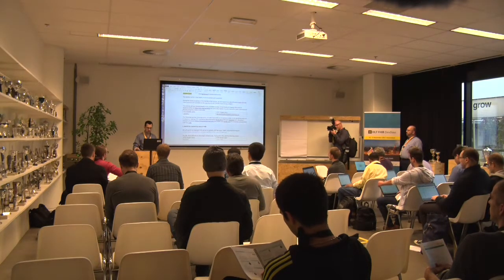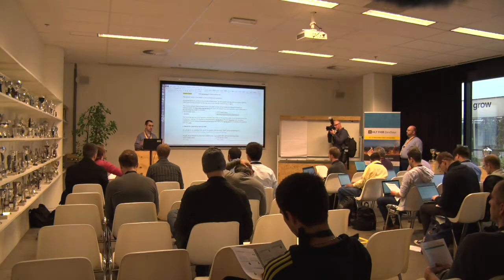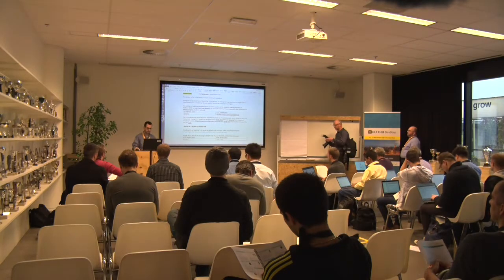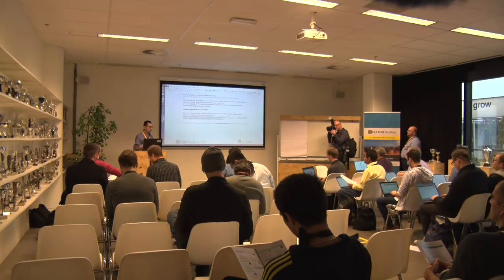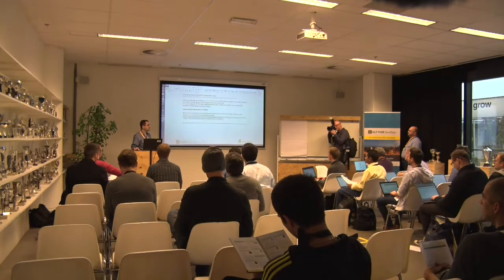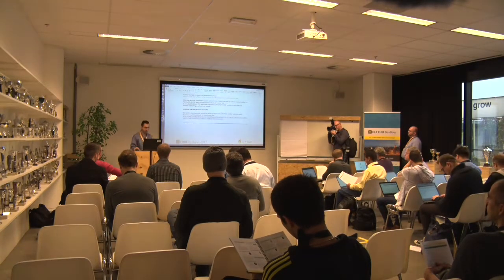So that's one thing. And then the other one is the thumbnail API is actually new and hasn't been implemented yet, so our server doesn't have it. But we will be able to get a JPEG rendering if you could tell it which frame you want within the study. Last but not least, I should just mention this before any of you start getting headaches with these URLs. When you see a long URL like this, I should have pointed this out yesterday, you don't actually need to type this entire thing. This is something that we'll find in the response. You can just copy it and paste it, and I will show you that in just a moment, okay?